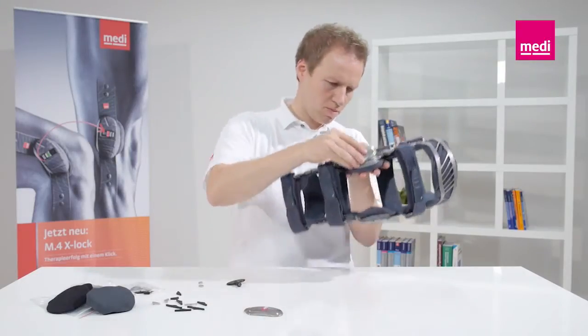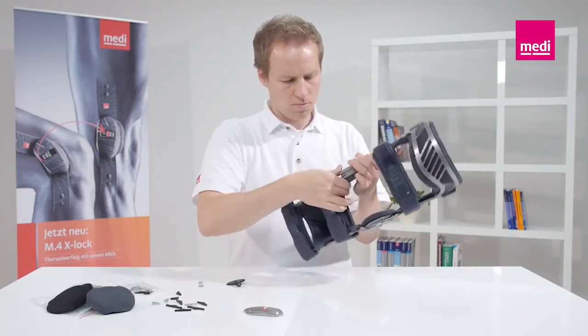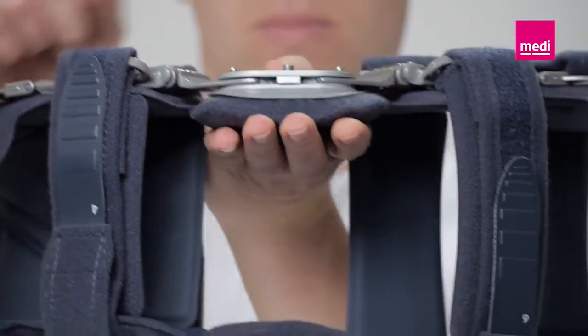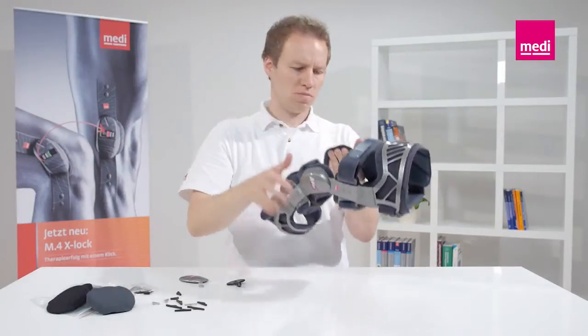Only the technician treating the patient may change the extension and flexion limits. In order to avoid hyperextension, extension wedges or zero-degree wedges must always be inserted.